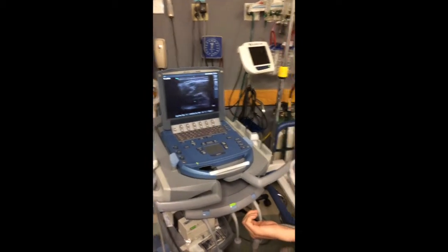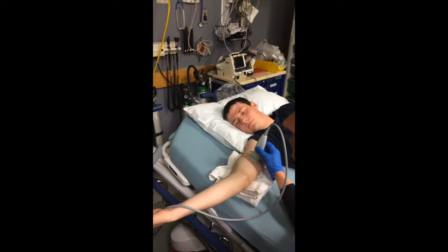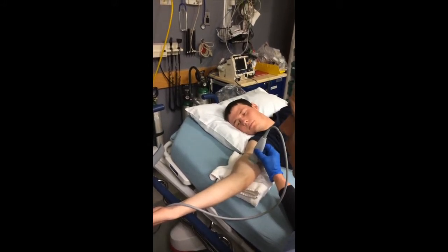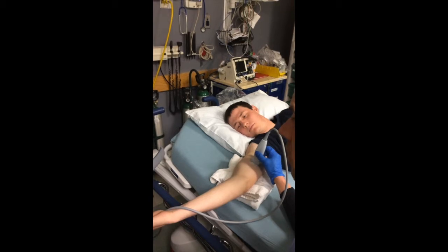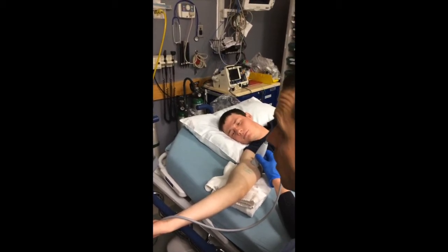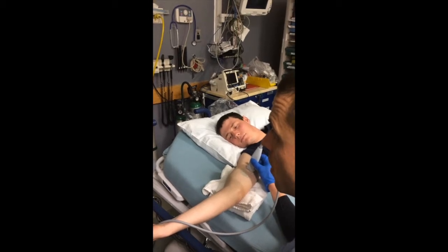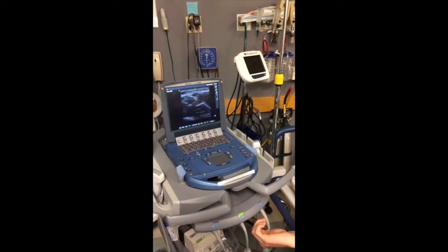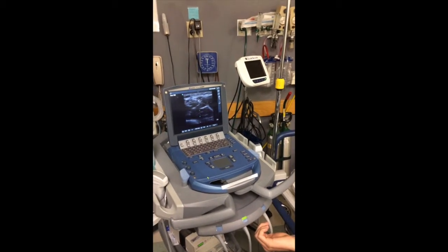The other thing I do is run the probe up and down the arm just to see where the vein is traveling, to see if it bifurcates, to see if it goes down or up, and see what kind of line I need to take on the vein. It looks pretty good. All right, so I'm going to wipe this off, clean it up, and we'll get ready to insert it.